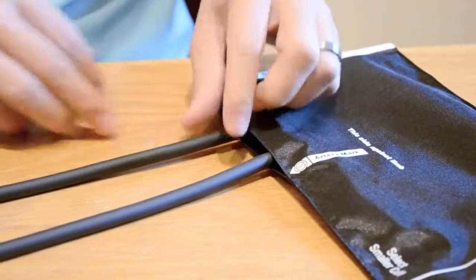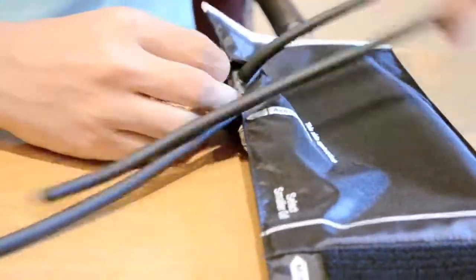Once the bladder is properly aligned within the cuff, the tubing is then threaded through the flap of material along the edge of the cuff opening, securing the bladder within the cuff.